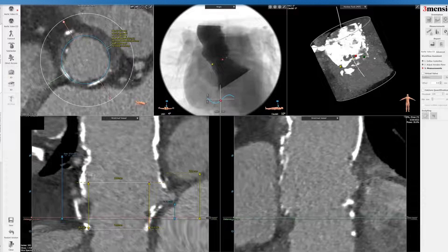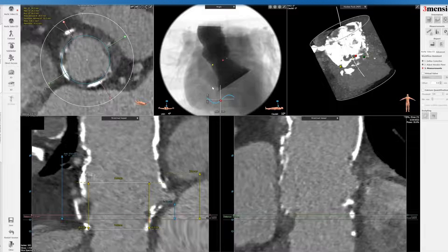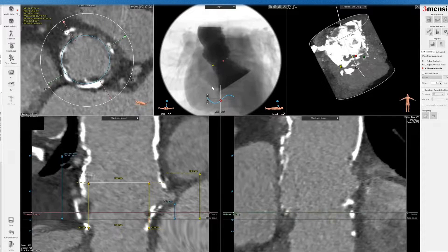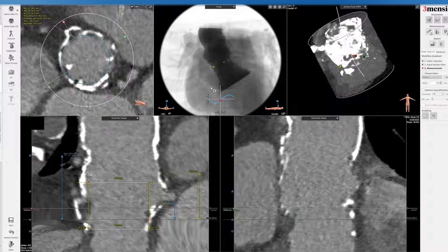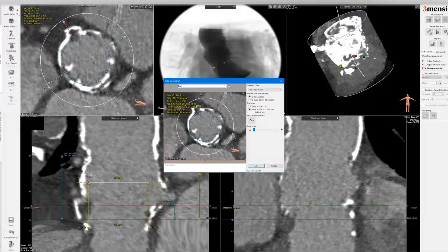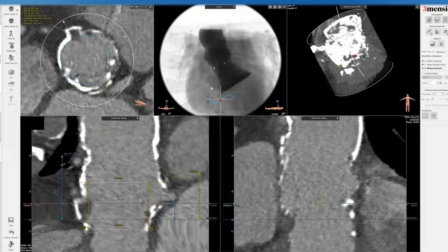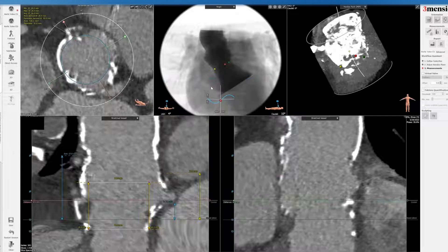If I'm going too quickly here, you can always go to my other prior video tutorials where I go into more detail and methodical analysis. I'll do the one-millimeter segmentation that I've done for all the other tutorials, going all the way up to 10 millimeters. You can see this particular homograft — the mechanism of failure is aortic insufficiency, which is typically the case. So you don't see a lot of leaflet calcium, but because the root itself is so calcified, we would typically be able to anchor the transcatheter valve in place.